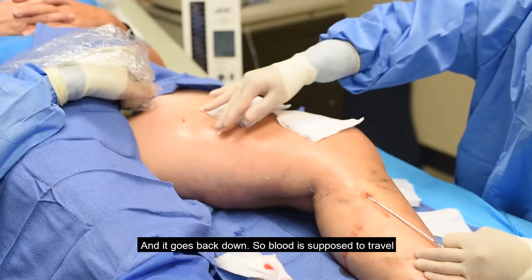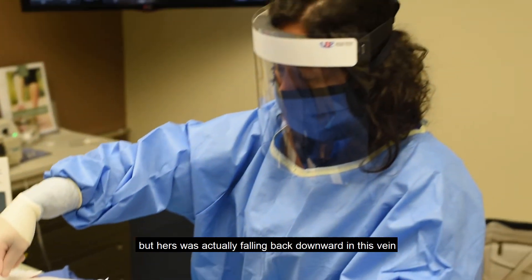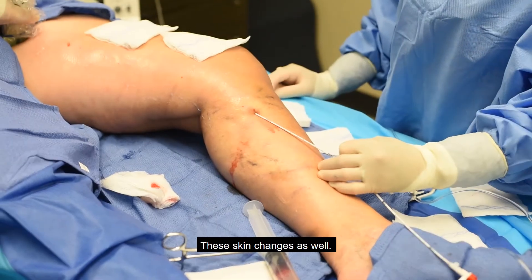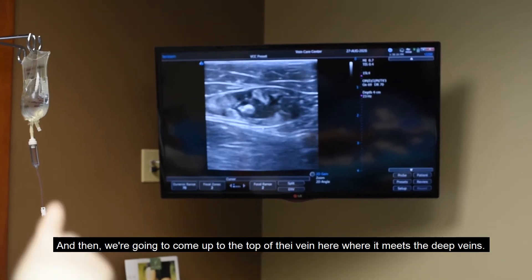Blood is supposed to travel up towards the heart to be recirculated, but hers was actually falling back downward in this vein. That's why she was getting these bulging veins and these skin changes as well. Now we're going to come up to the top of the vein where it meets the deep veins.